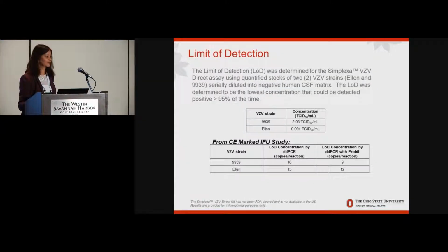The LODs, as I keep talking about spiking the LOD, how do they determine the LOD for the Simplexa assay? So by the way, these data slides I'm showing are really all for informational purposes because, as you all know, this assay is currently with the FDA and they're awaiting approval. But I think it made a lot of sense to just at least show some of the data that has gone into the submission for this talk today.